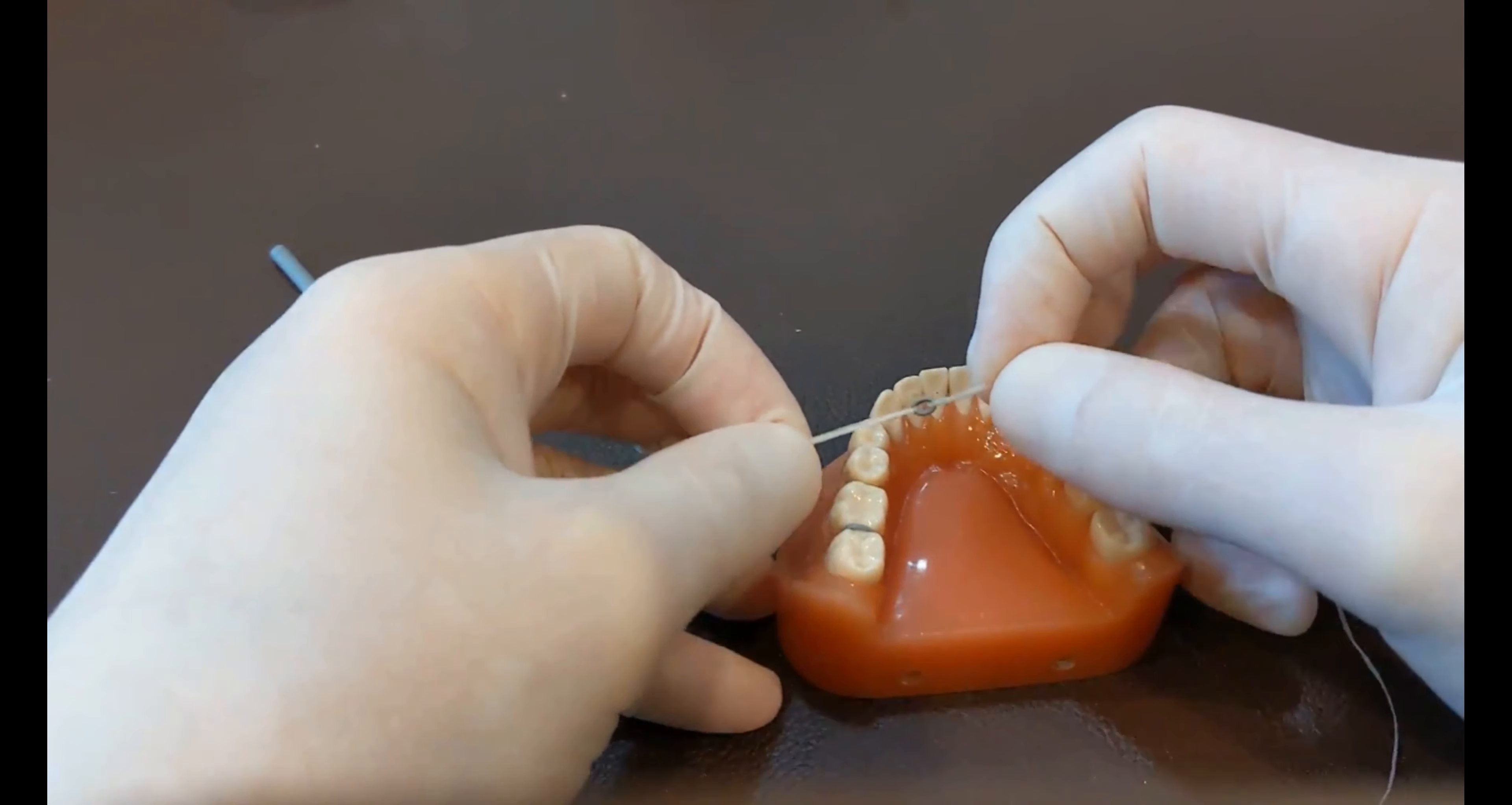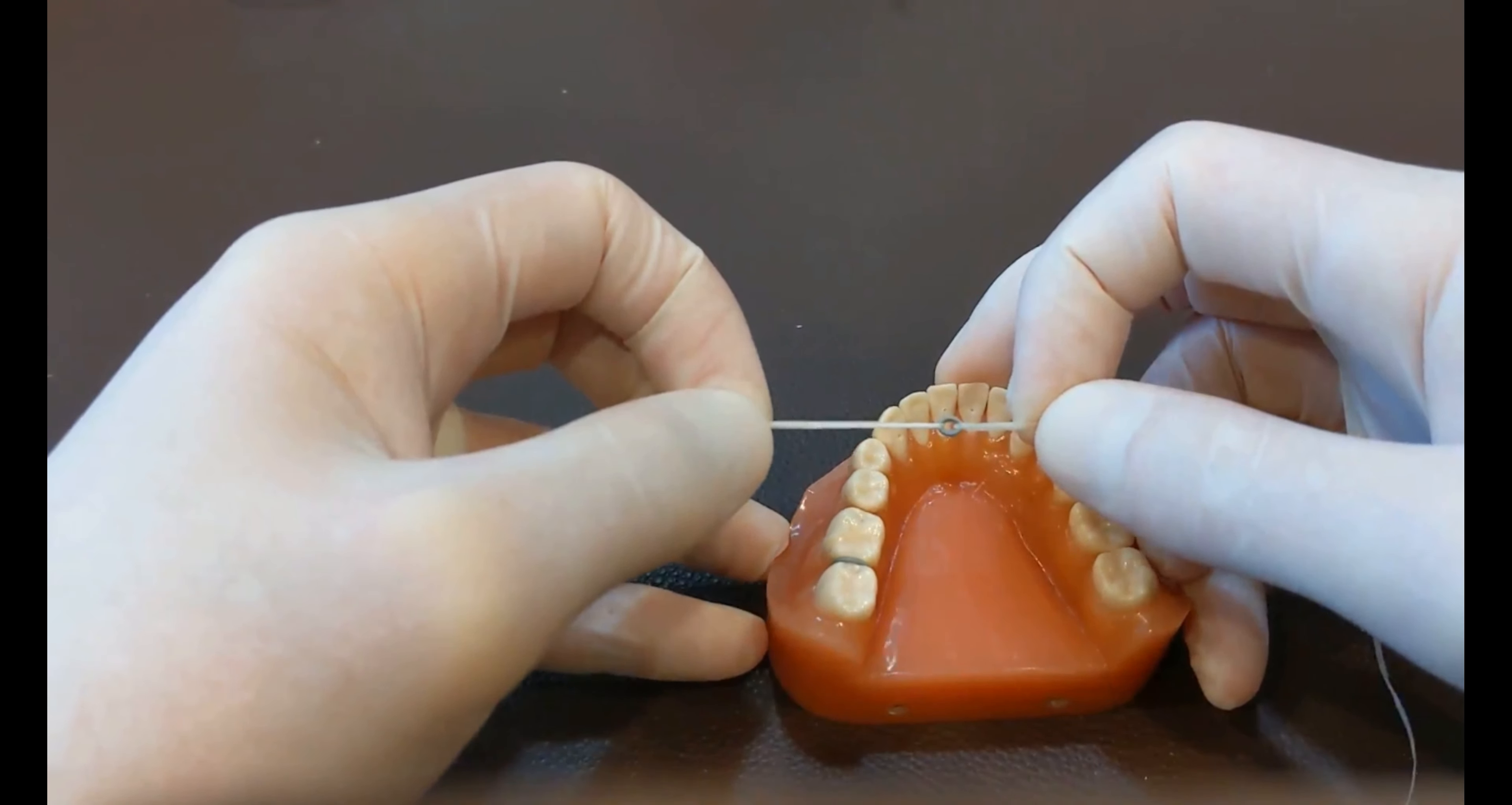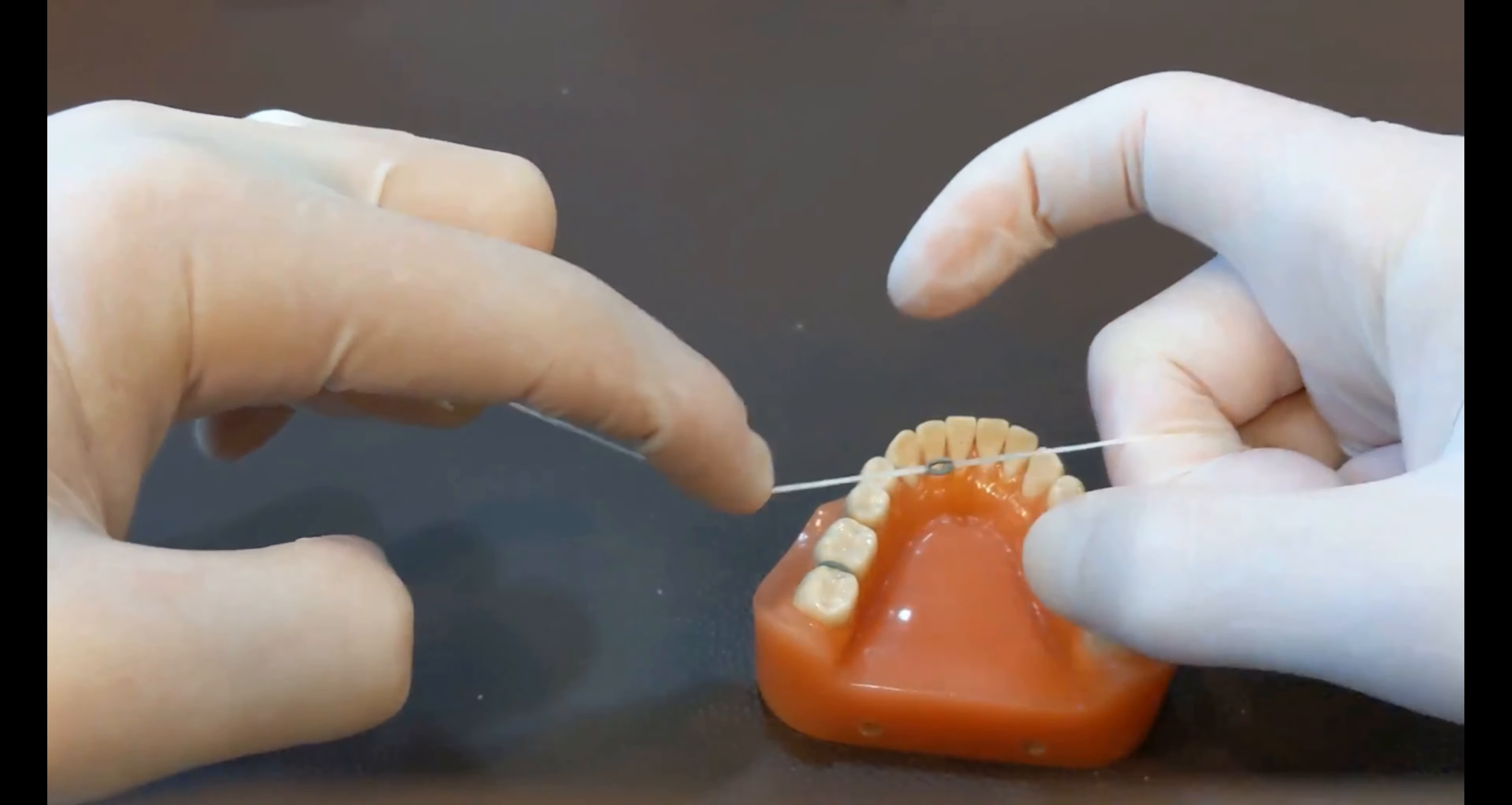So then you go inside the patient's mouth, and let's say we're gonna put one right here. We're gonna fit a band on the six. We already have one between the six and the seven. We're gonna put one between the five and the six. So what you do is, I personally like to wind it around the middle finger on one. That way I can get a good pull, like to pull it between.